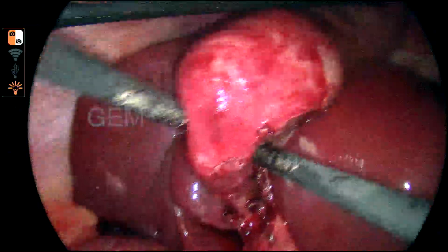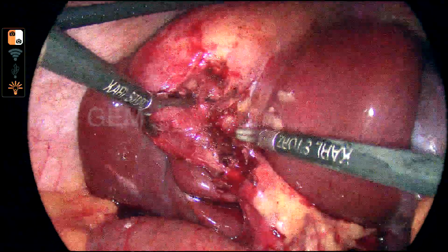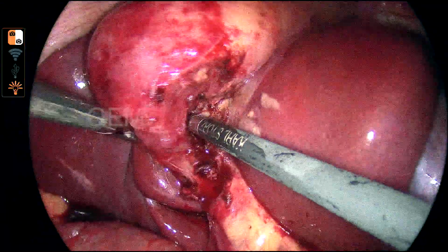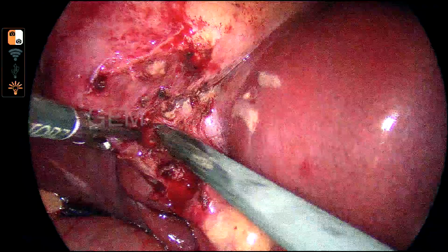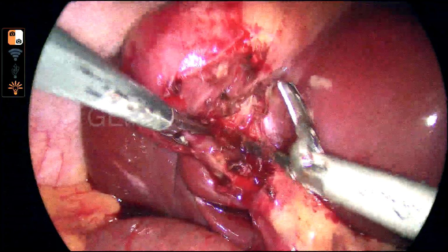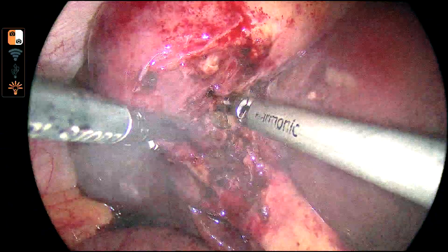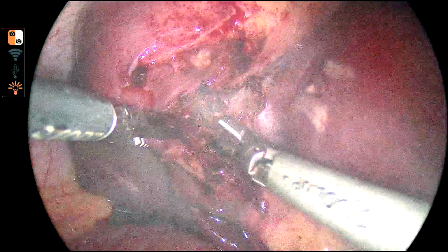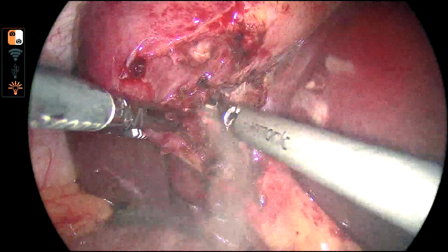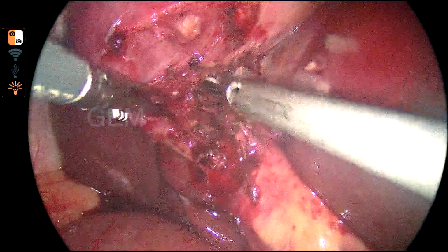I am just checking my instrument here, so it is able to see. So these vessels are again going to the gallbladder. So I have to coagulate the vessel, and it must be from the posterior cystic artery. So the patient has a posterior cystic artery also. That also I have to carefully dissect, and then clip and divide, because torrential bleeding happens because of the posterior cystic artery.